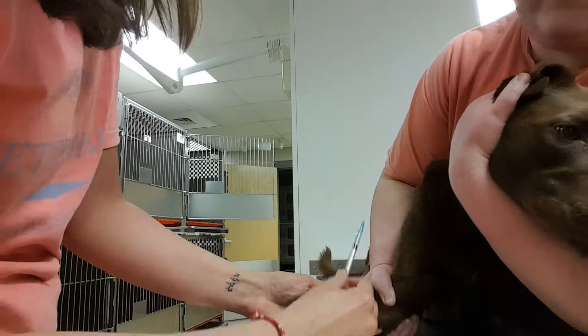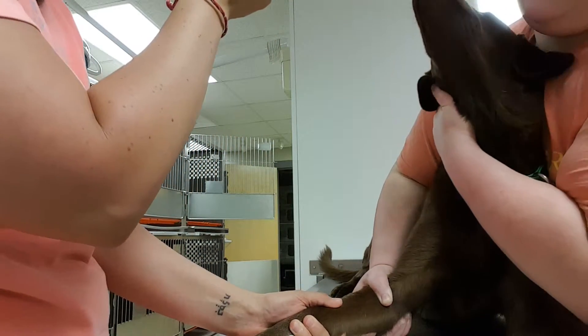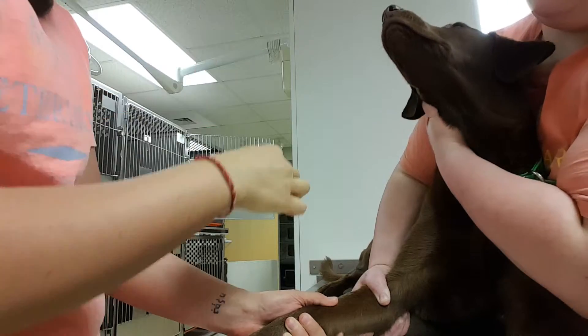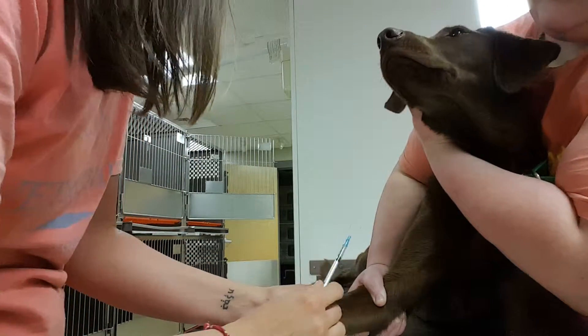Hang on girl. Okay, let me try it one more time. Hang in there, Bentley.